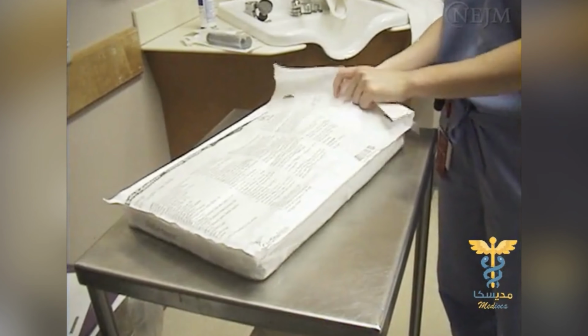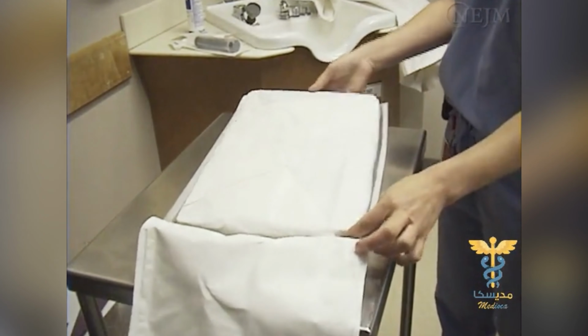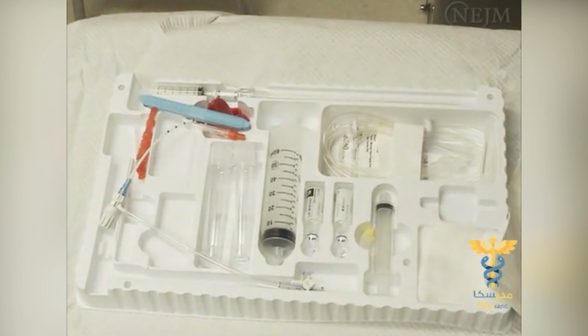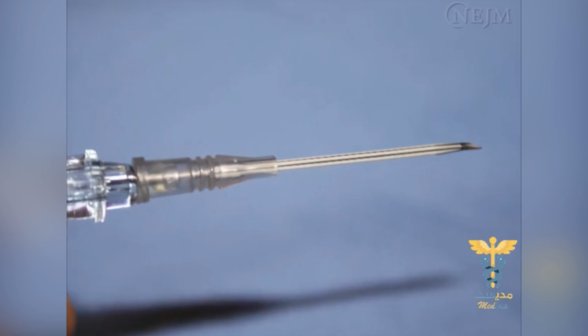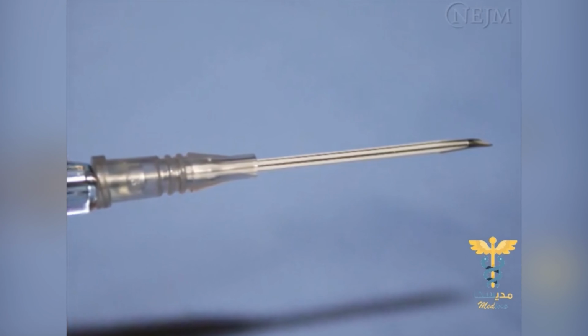Numerous devices, which are frequently available in prepackaged kits, can be used to perform thoracentesis. You should become familiar with the specific devices available at your institution. In this video, we will use a standard intravenous over-the-needle catheter assembly to demonstrate the procedure.